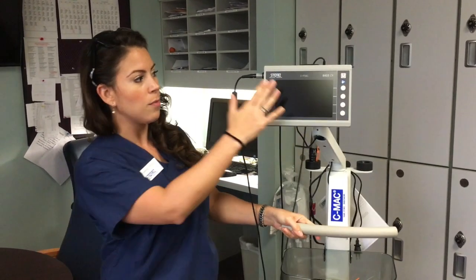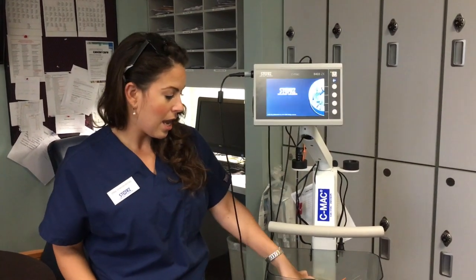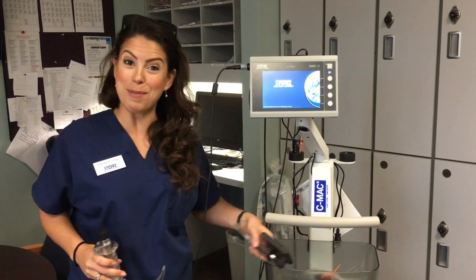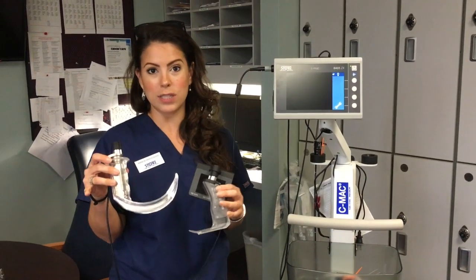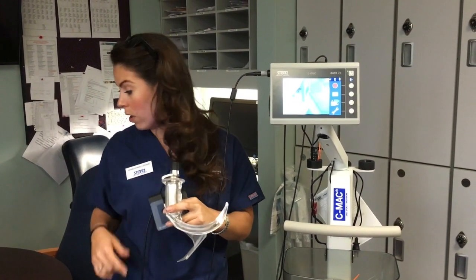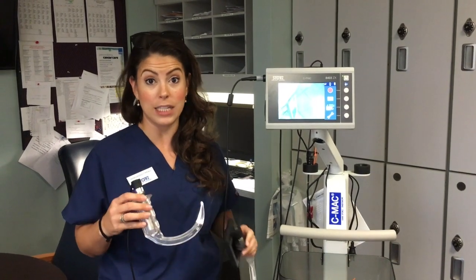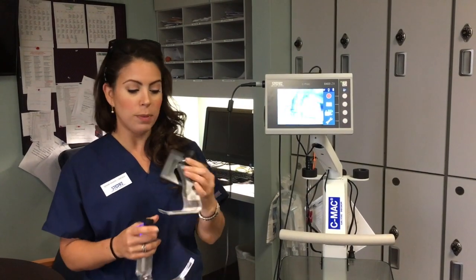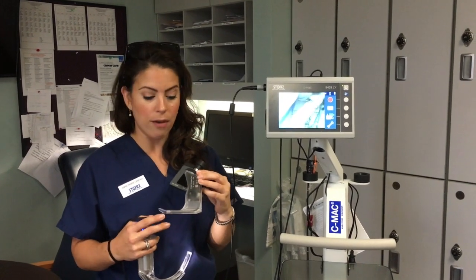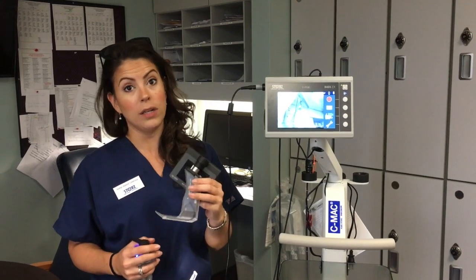Instead of the blue bag, your monitor is now on a cart with an on button. And instead of reusable blades, you now have disposable blades for adults and pediatrics. Adult shapes are MAC 3, MAC 4, and the hyper-angulated D blade for difficult anterior airways. Pediatric blades are Miller 0 and Miller 1, so you now have video laryngoscopy options even for your pediatric patients.